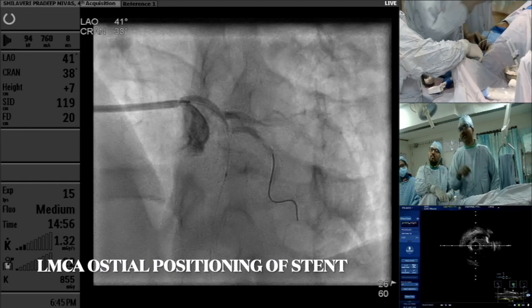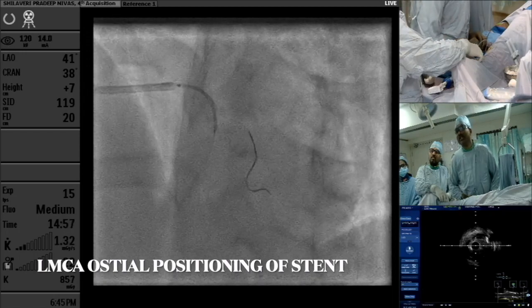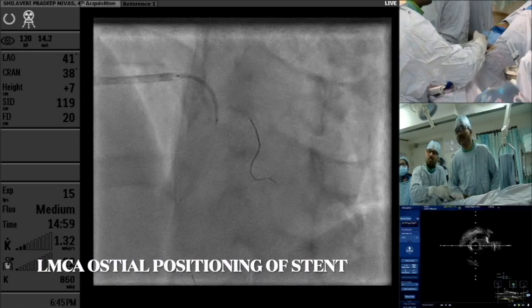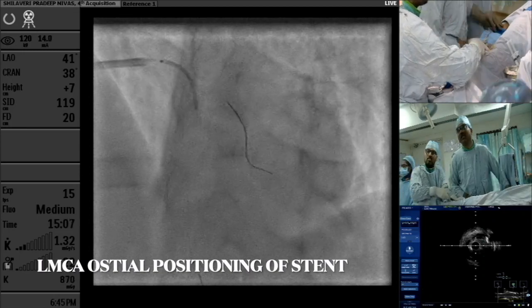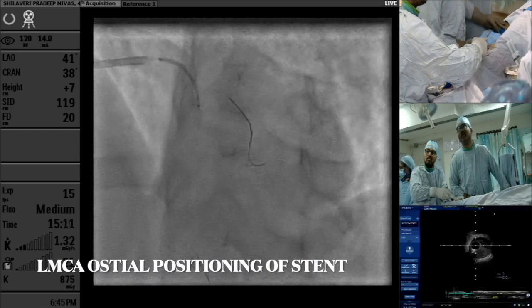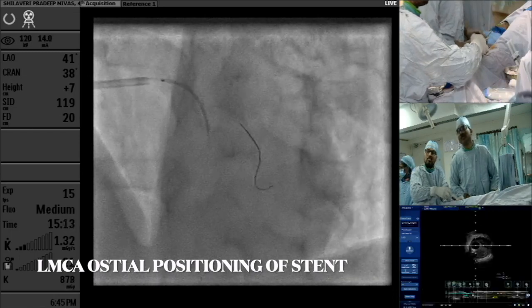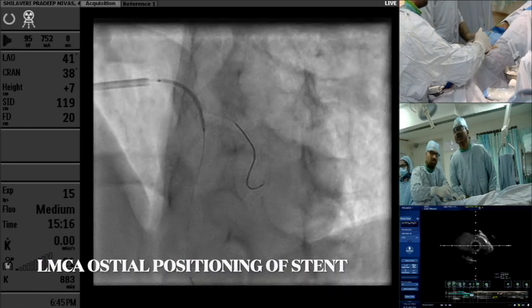Okay. So the tip. Just check again. Oh, I think I'm a bit out. Okay. Yeah, I think now, check, please. Yeah, that's perfect.